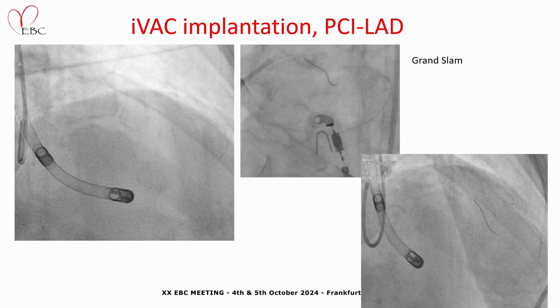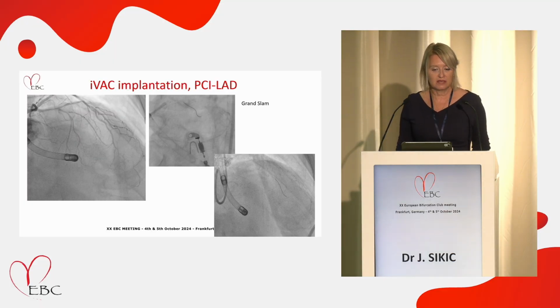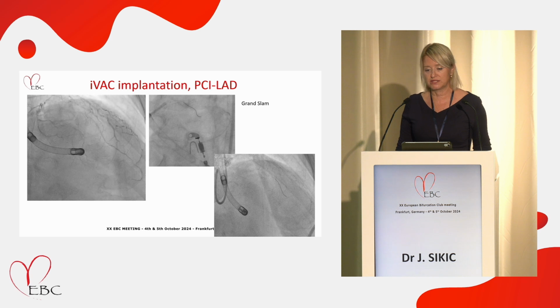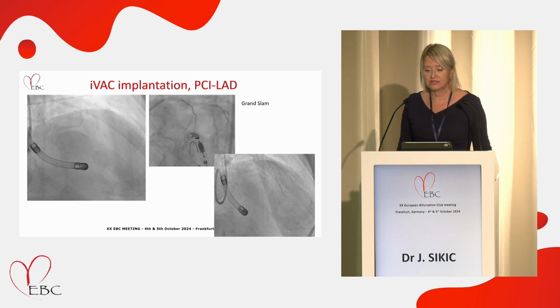So we decided to put in an IVAC, not just for him, but also for our convenience, because we thought that we would feel safer and better if he had an IVAC. So we implanted the IVAC, and you can see here the situation we have on the left branches. So I took a Grand Slam. There was a little bit of a problem with the ostial part due to calcification.